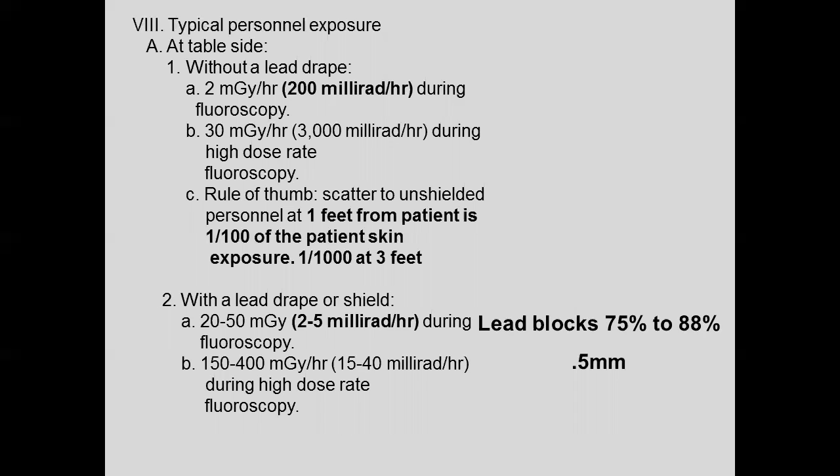So if you're using standard radiation protection, the dose to the patient, we've decided, I don't know who we even are, somehow I'm grouping myself in that, we don't need to use a rad pad for diagnostics. If a doctor asks for it, I think it's more than reasonable. I am more than willing to give it. They're $50. So $50 for a 2-minute procedure, they're not recyclable. They're one-time use. So that's where the cost-benefit analysis is.